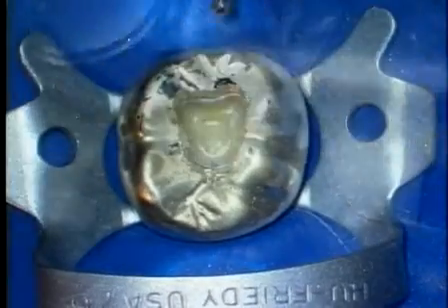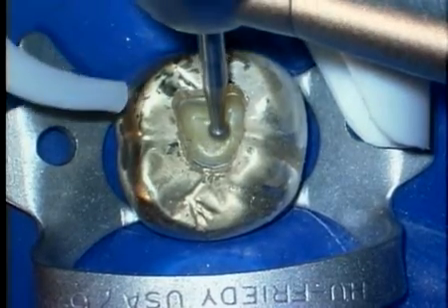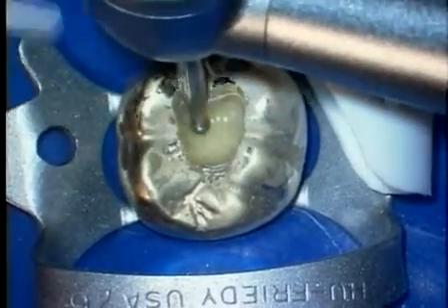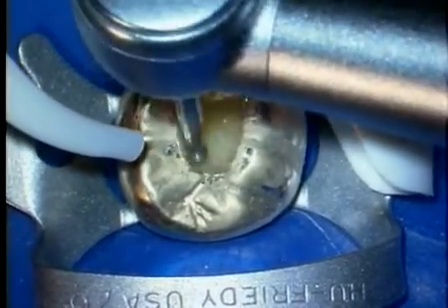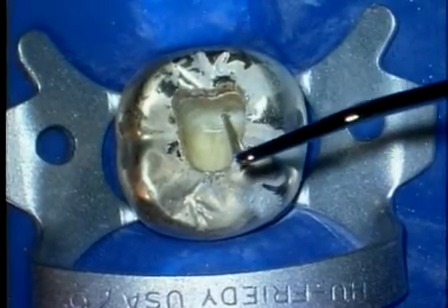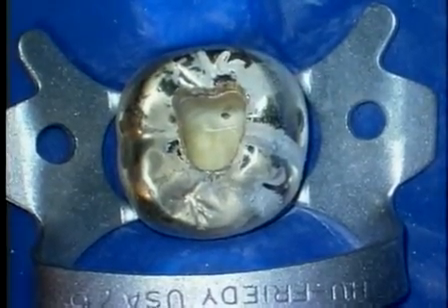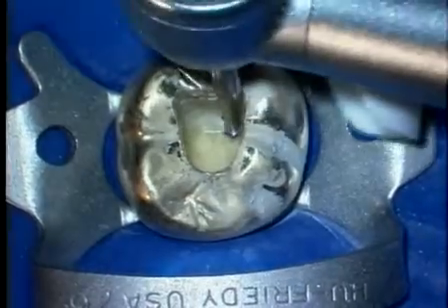Once that's accomplished, we can go to the surgical length carbide number 4 round burr. Use it like a brush and sweep back and forth. Notice we're using no water during this procedure because we're not trying to protect the pulp, we're going to be eliminating the pulp, so this improves our vision. The Explorer demonstrates the initial entry into the pulp chamber, traces the expanding outline pattern, and confirms the access preparation is on axes. Let's go back to the 4 round burr and do a little bit more removal towards the pulpal roof.